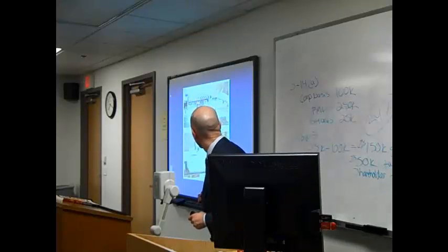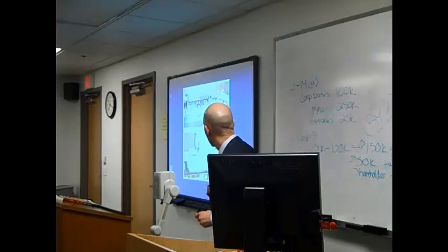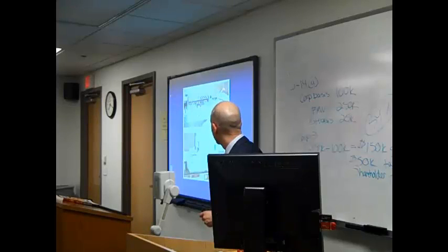Here, sorry, kind of hard to see, but here's the vial. Here is the auto pipetter, and it's just connected to an internal standard, and it's going right into the blood sample. The lab chemist is just pushing a button.